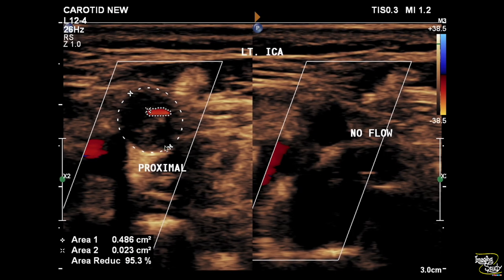Here's the proximal left internal carotid artery showing a very tiny lumen with around 95% luminal stenosis. Just after that part, you can't see any flow within the lumen due to the sonolucent plaque occluding the lumen completely. Now let's see on real time.